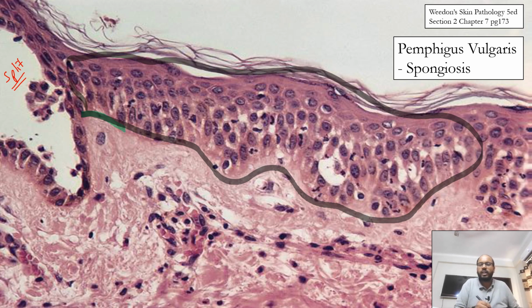And this spongiosis is localized majorly at the deeper layers of the epidermis, the lower layers of the epidermis. You can in fact see the basal cells here. They're trying to form a row of tombstones. Okay, and if these vesicles coalesce together, they come together and become large, it will lead to a split, and that is what you're seeing here. Look here, this is a split, and this is a row of tombstones, and these individual cells are nothing but acantholytic cells. This one is, I think, a neutrophil. Yeah, but all of the larger cells are acantholytic cells.